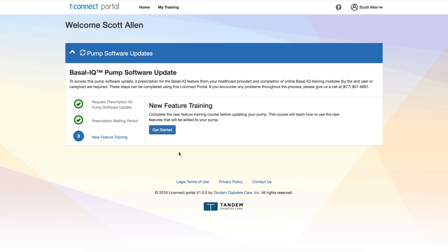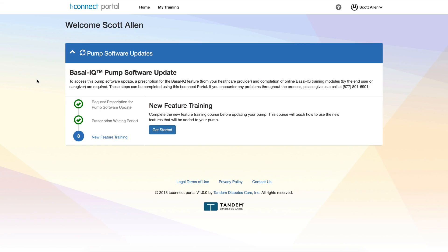I'm going to film this on my computer screen so you can actually see what I'm doing. When you log into the tConnect portal, it shows your name and underneath, pump software update — the Basal IQ pump software update. To access this, a prescription for the Basal IQ feature from your healthcare provider and completion of online Basal IQ training modules are required. I've already gotten the prescription done, it's approved, and they've loaded the training into my profile.